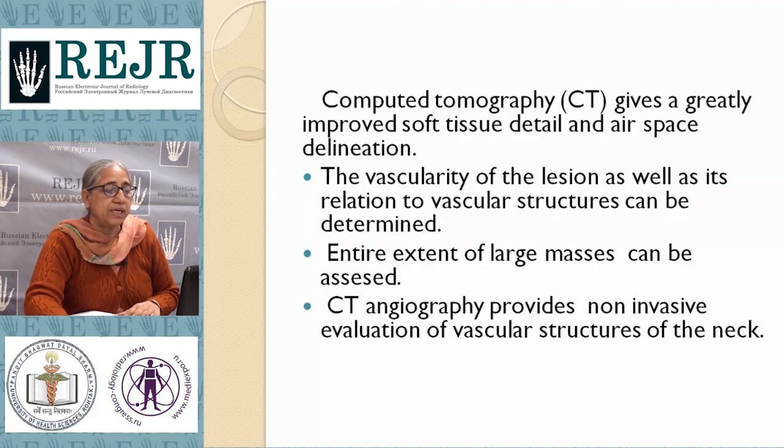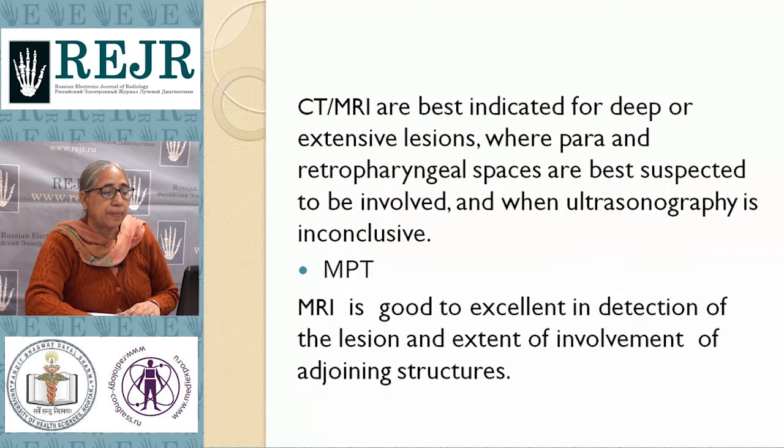CT gives a greatly improved soft tissue detail and airspace delineation. The vascularity of the lesion as well as its relation to vascular structures can be determined. Entire extent of large masses can be assessed. CT angiography provides non-invasive evaluation of vascular structures of the neck.